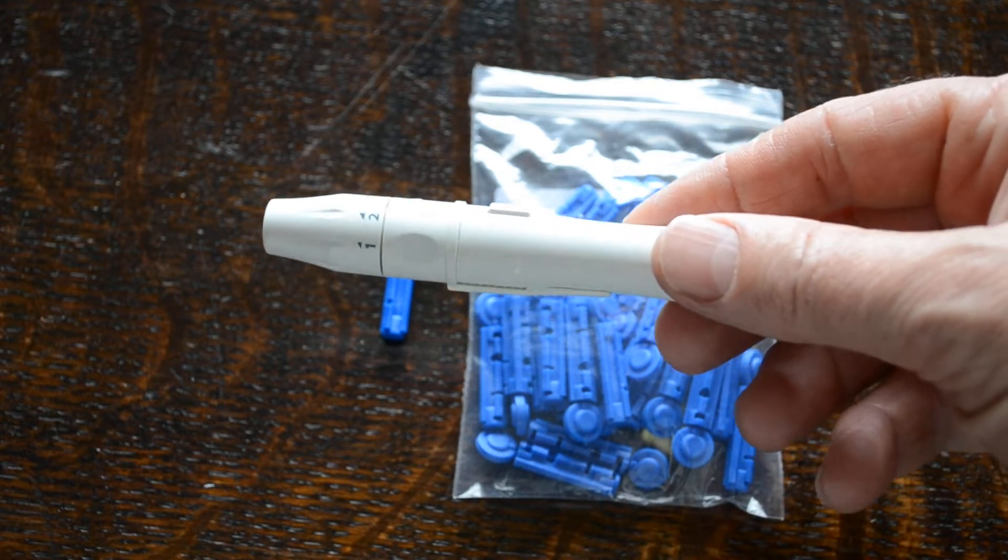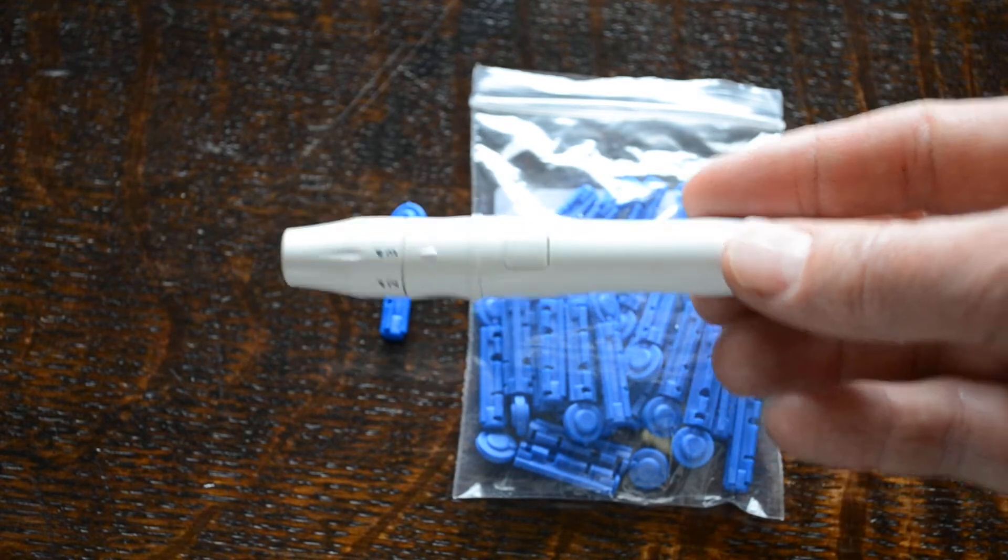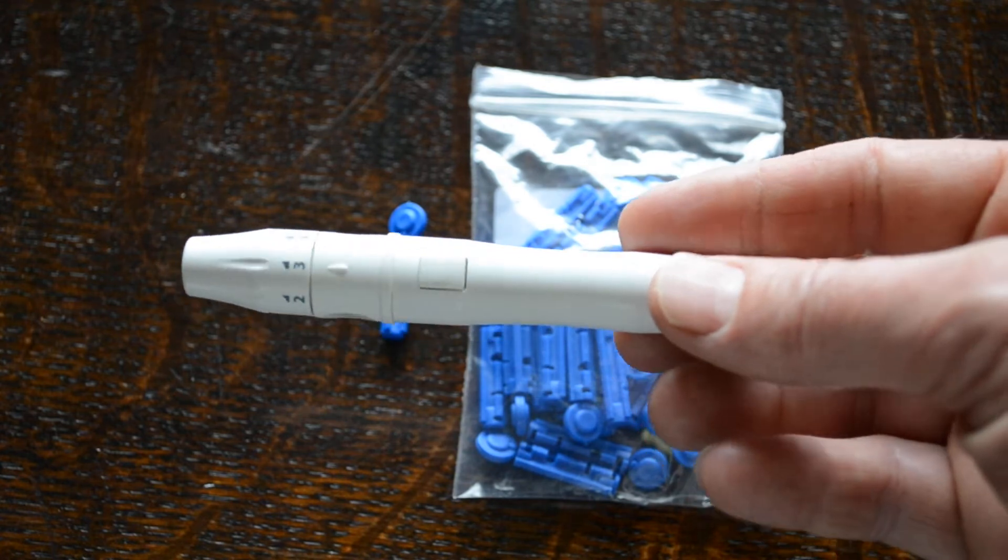These are blood meters or monitors for checking parameters such as your blood glucose level, blood cholesterol, blood haemoglobin, or even blood uric acid.